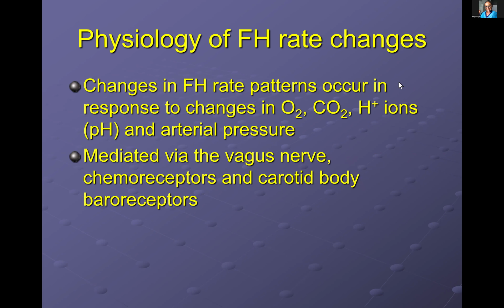So the fetal heart rate does change in response to changes in oxygenation, the oxygen levels in the fetus, and of course the oxygen it's receiving via the umbilical cord, right? CO2 changes, H plus ions, that is the pH, and arterial pressure.